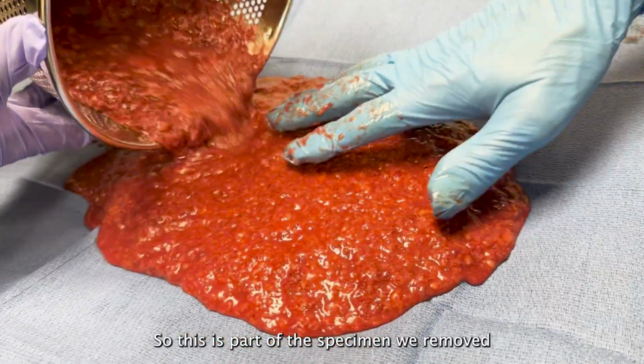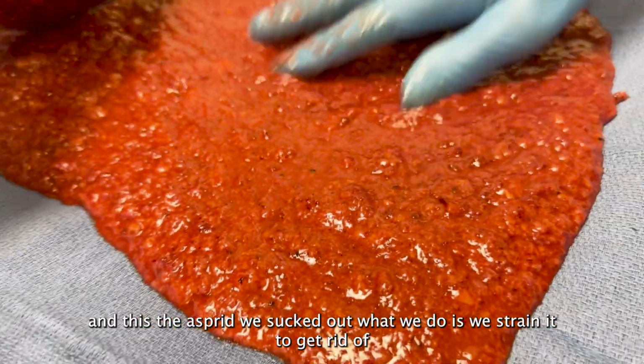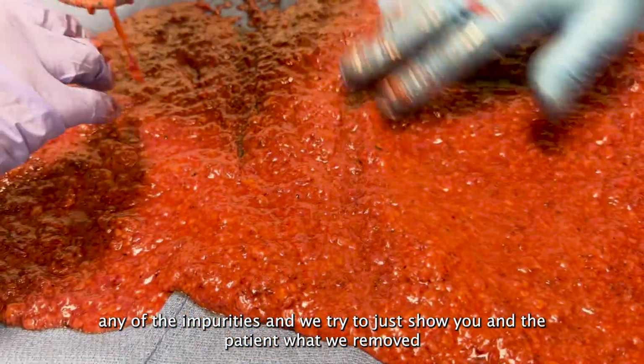So this is the part of the specimen we removed, and this is the aspirate, or what we sucked out. And what we do is we strain it to get rid of any of the impurities, and then we try to just show you and show the patient what we removed.